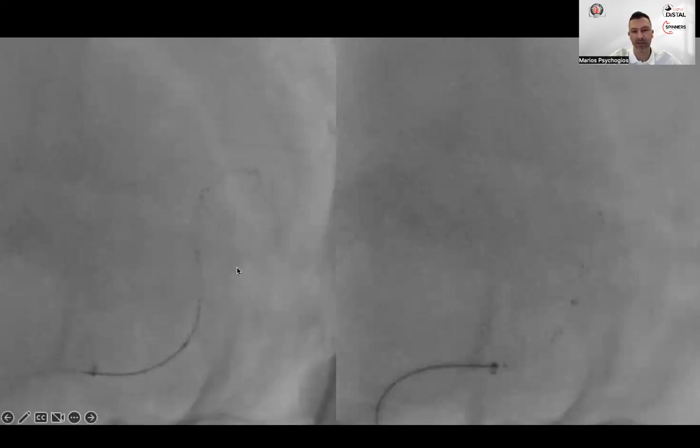Again, so we've done this here. You can see we have gone to the clot. We have retracted the stent retriever a little bit, so we actually wedge this whole system. Then what we do is we retrieve the system towards the large aspiration catheter in the M1. One point that's important, as you will see also in the next slides, is when you start with aspiration. The point is that I start my aspiration in the moment I reach the clot with the 3 Max here, for example. I haven't started the aspiration on the proximal catheter yet.